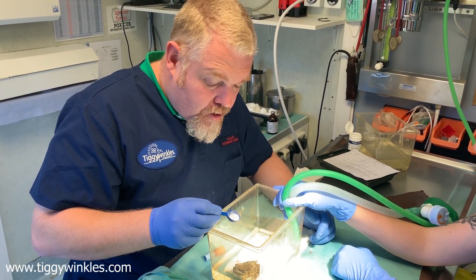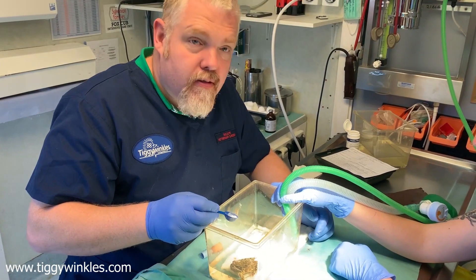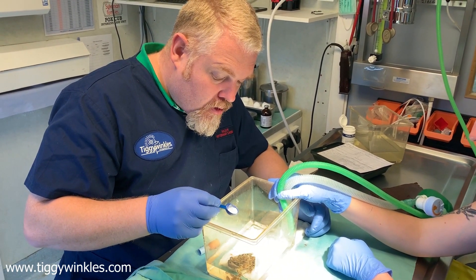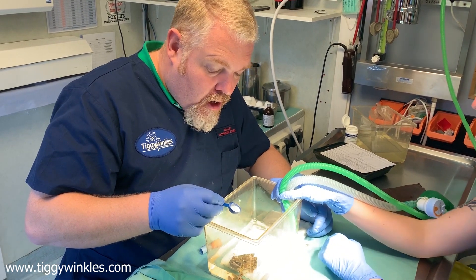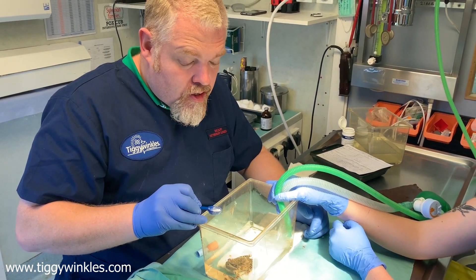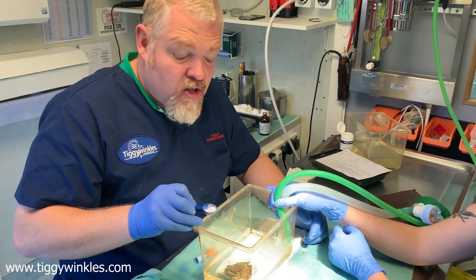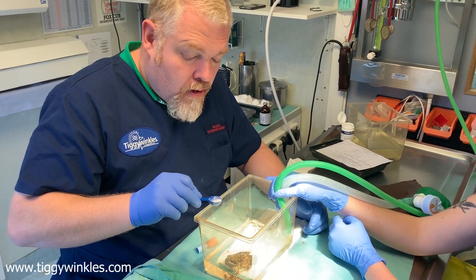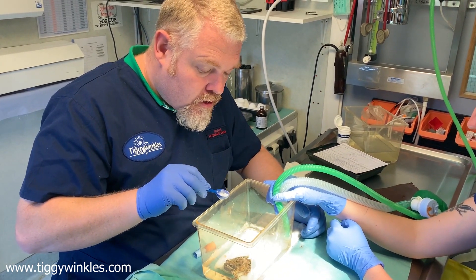This frog has damage to its right front leg — it's been attacked by some sort of trauma. He's lost his right leg up to the level of the humerus. What we're going to do is anaesthetise him to assess the wound and to debride it, tidy it up, and put the bone back where it needs to be. Hopefully he'll be fine and not get infection and not be in pain.